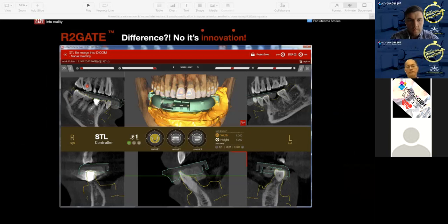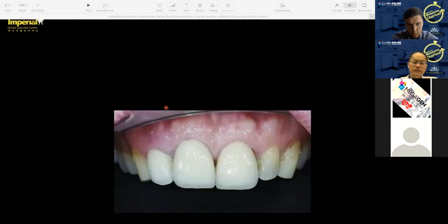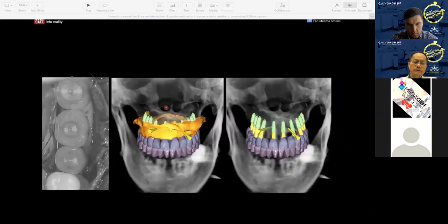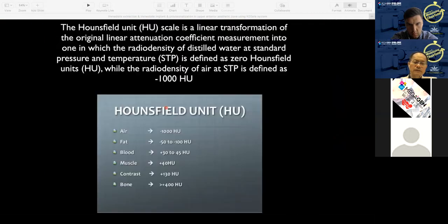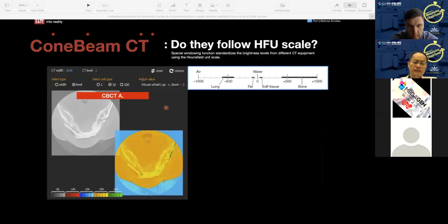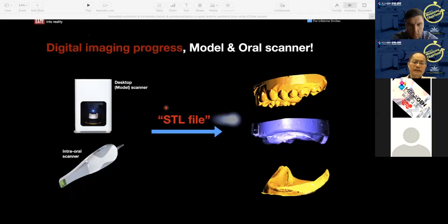Say for example, now here, we actually took a CBCT using a tray here. Now this tray here is actually produced in a DICOM file. Right. So at the same time, we actually have a model here when we do a model scan. So the model scan here, which means that we actually have this. Let me just show you this one. Sorry, I think I passed already. So this model scan here, yeah, here it is, okay?